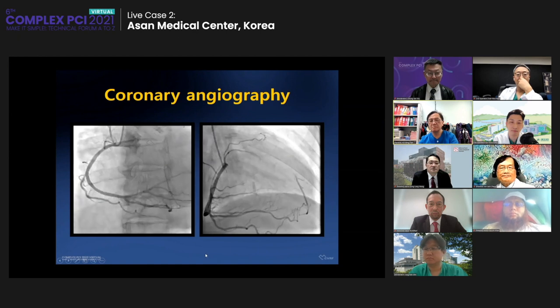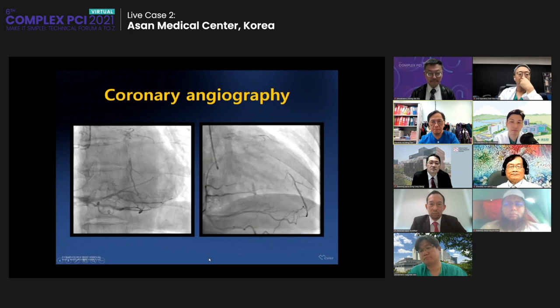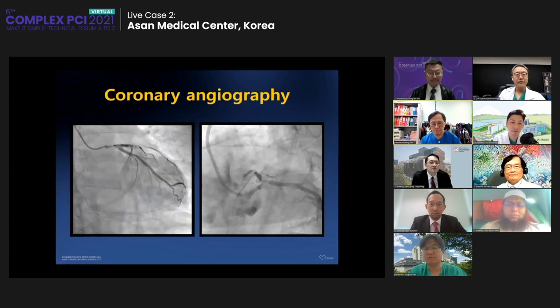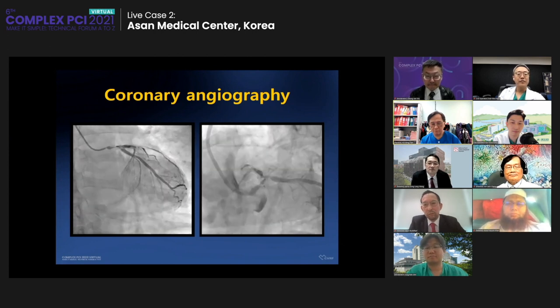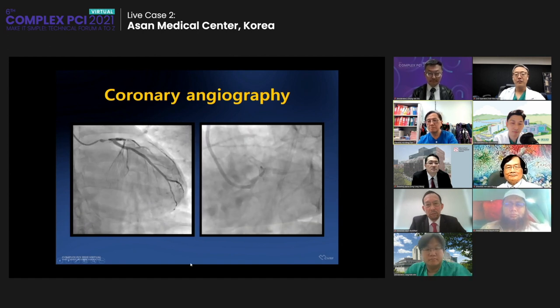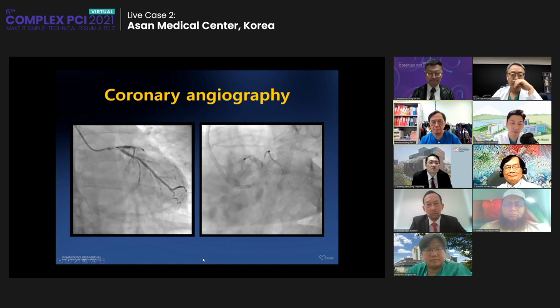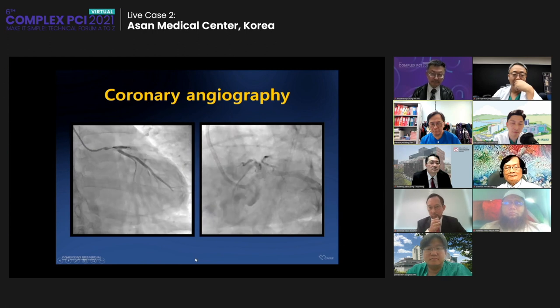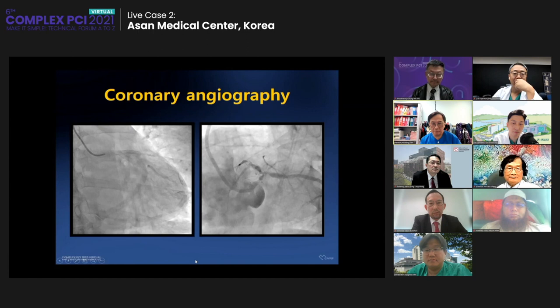Right coronary angiogram showed good collateral flow to the distal LAD. Next. There was an immediate damping of pressure as we engaged the left main. And without a doubt, this is a very severe left main bifurcation disease. Also, the ostium of the circumflex is severely stenosed. Next.